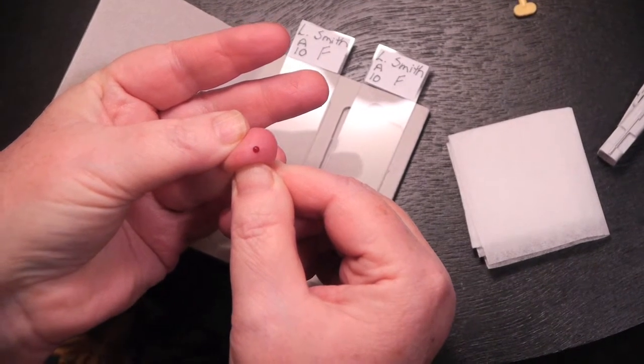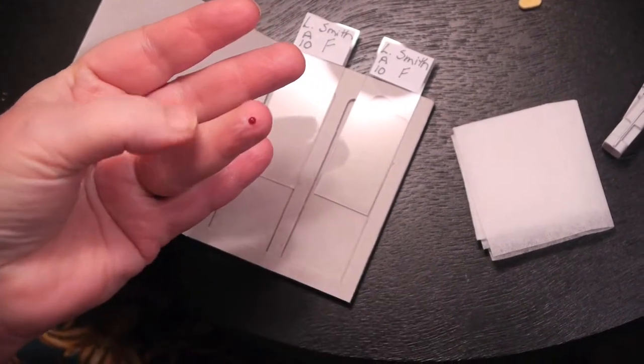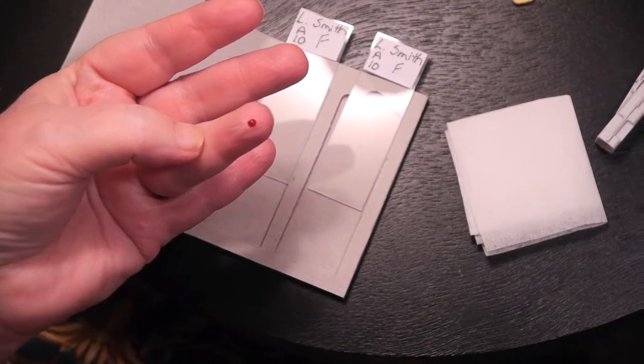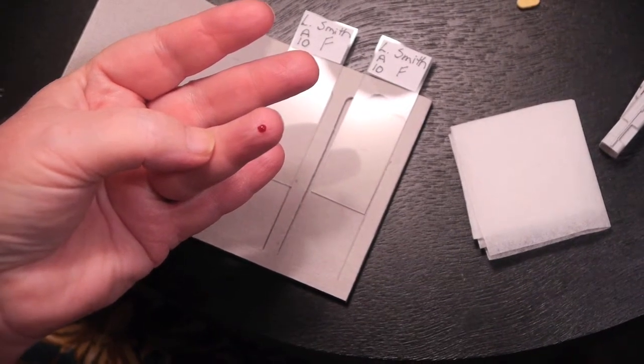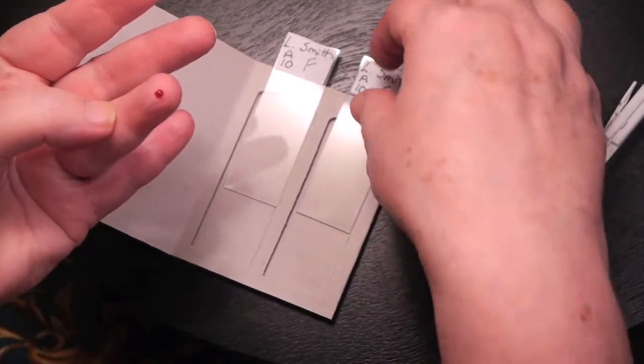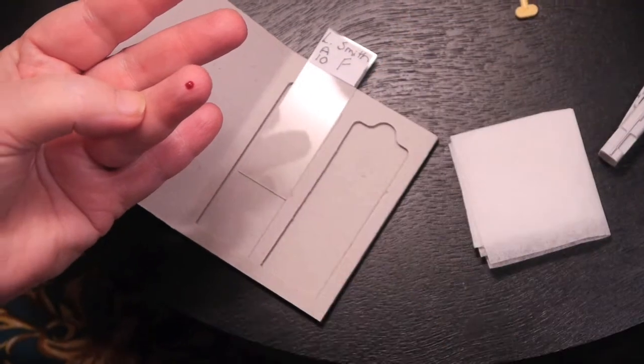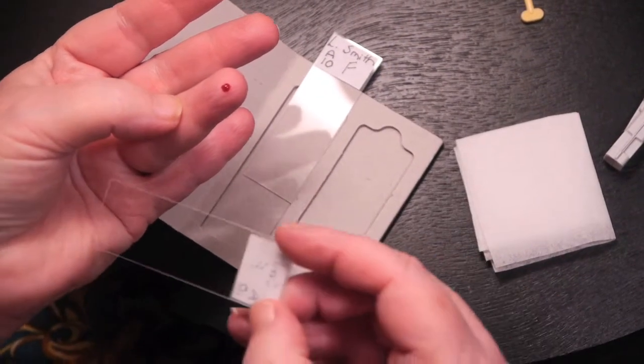Wait for the blood drop to stabilize on your finger. You don't want a bunch of blood coming out. If your blood is not stabilizing, first wipe away what comes out and then wait for a solid little bubble to form on your finger.